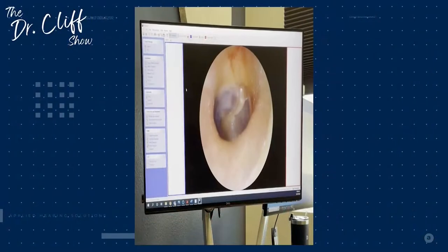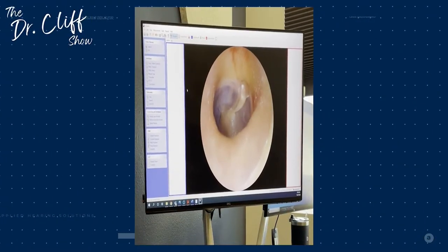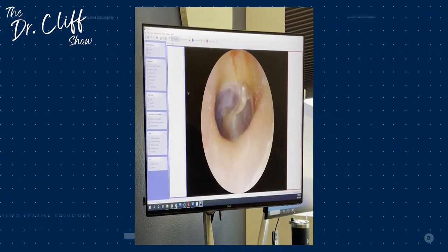And we can send those photos to whoever we want to. Sometimes patients want their own photos. And sometimes we're referring that patient to an ear, nose, and throat physician. Mm-hmm. And the ear, nose, and throat physician would benefit from having, okay, what did that ear canal look like last week when they were in your clinic? Right. And there might be some change that happened inside of that window. So the ability to take a snapshot of that and send it off to another professional is extremely beneficial.